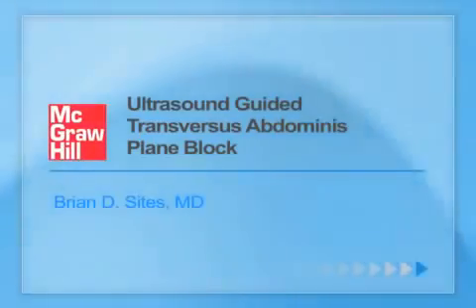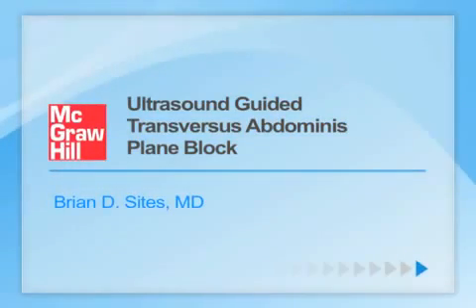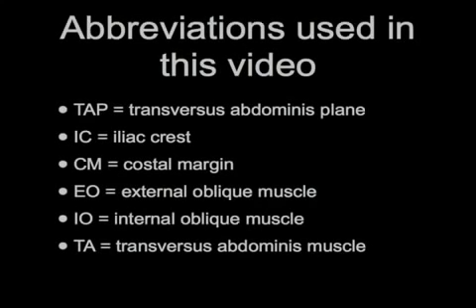Welcome to Ultrasound Guided Transversus Abdominis Plane Block. There are several abbreviations used in this video. Please note them here.